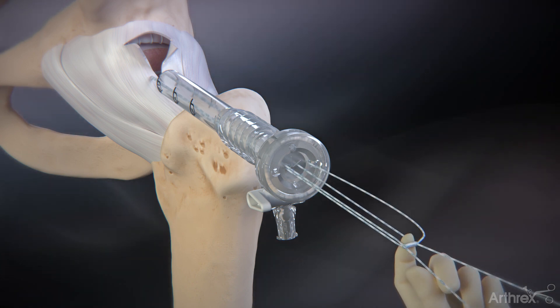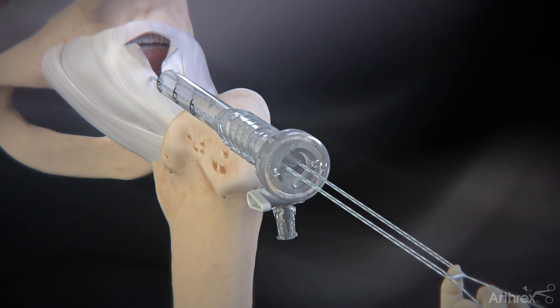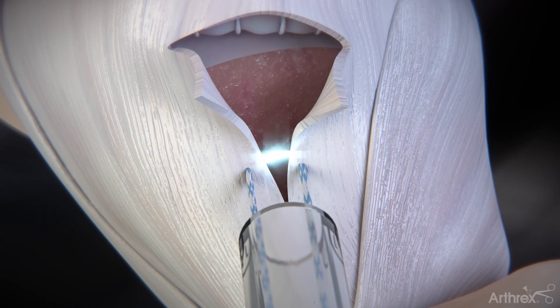Put one finger behind the suture splice and pull slack out of the loop-lock suture until the interlocking loops are positioned under the capsule.